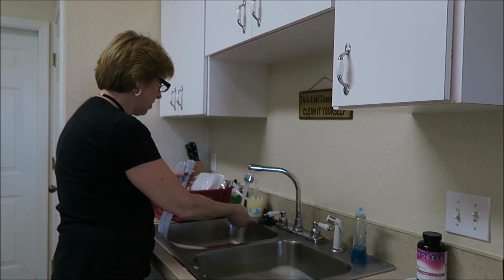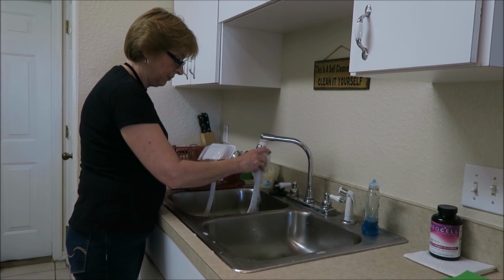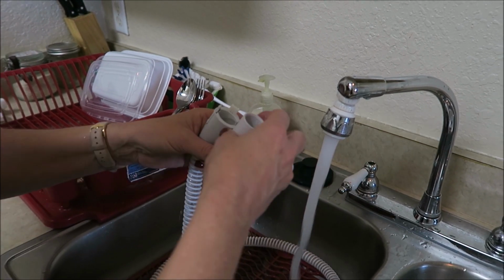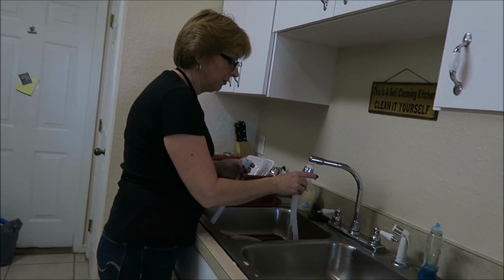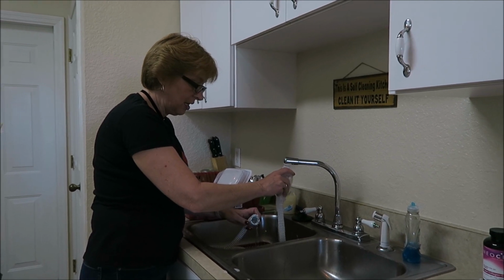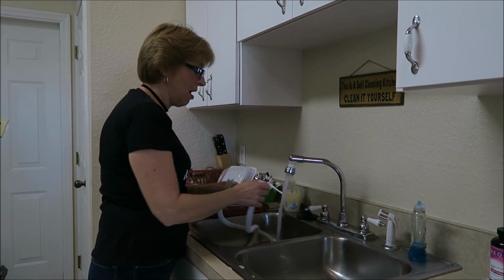Now I'm going to run the hot water like so. What I do with this is I let that water completely fill and let it run out of here. I know some of you probably can't handle really, really hot water, so if you have to take a break, take a break. Then I completely dump it and do it all over again. This way I know there's no residue from the soap. That's why I don't use a lot of Dawn. See, it's flowing out of there pretty good. And there she blows one more time.